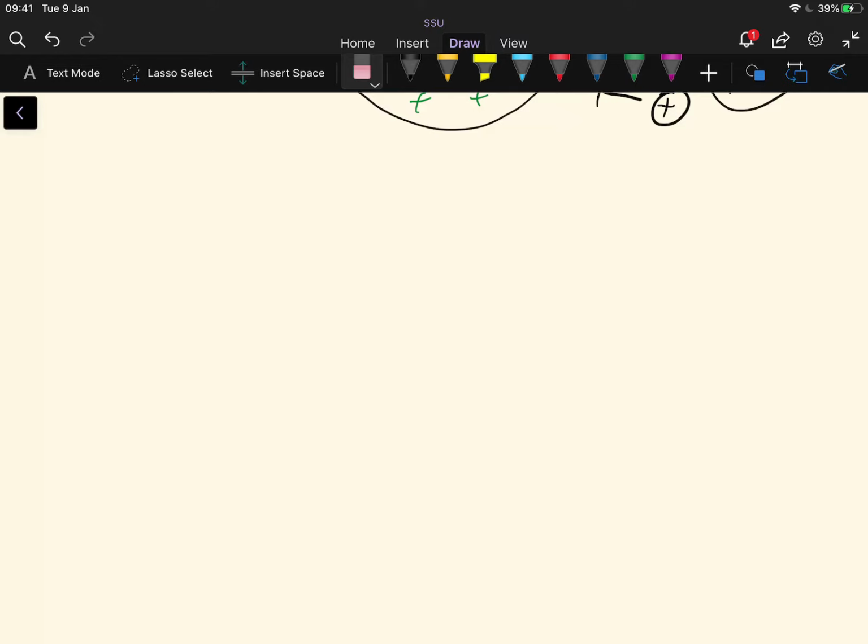So, remember, leads are positive. If we have, let's say the ventricle, we'll just stick with the ventricle for now. If we just have a lead here that is positively charged, if we have negative charge moving towards a positive lead, we have opposites moving towards each other, we get an increase in voltage, an increase in signal.